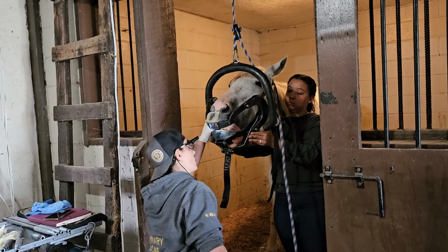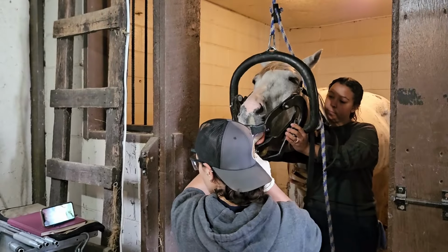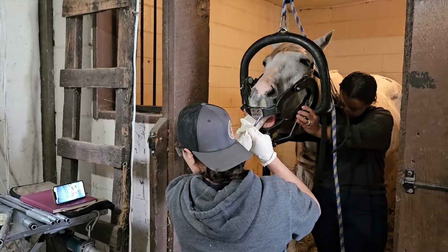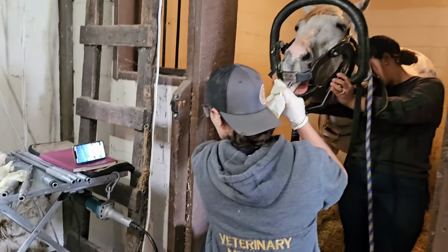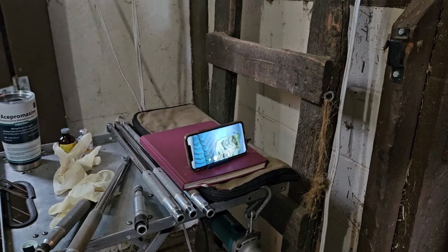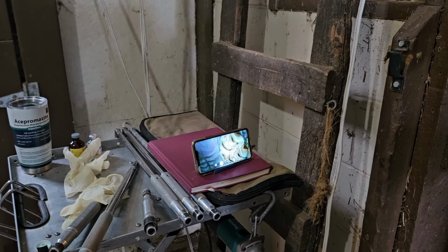So I really recommend a vet that can be looking with a camera to really see what's going on, but also somebody who's really knowledgeable and has a lot of practice, because if they use the power tool too long without giving it a rest break to not overheat the tooth, that's where a lot of issues can happen, or if they overfloat. So there's a bunch of things that can go wrong. So here they're able to really look at the teeth and see a lot more.